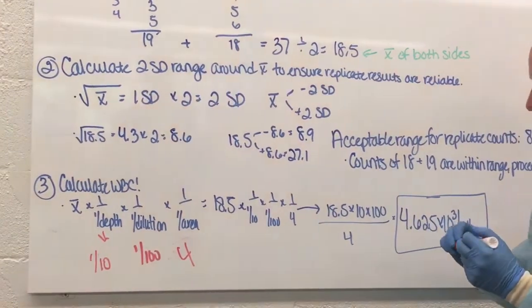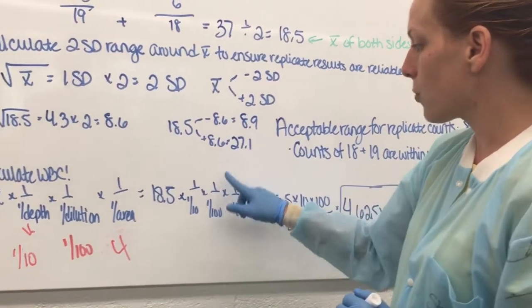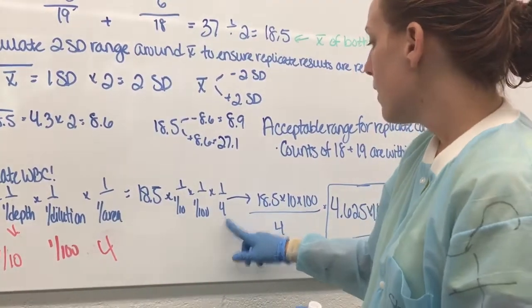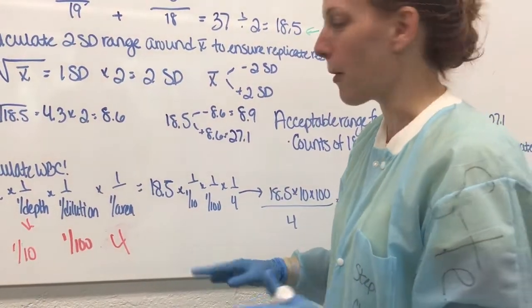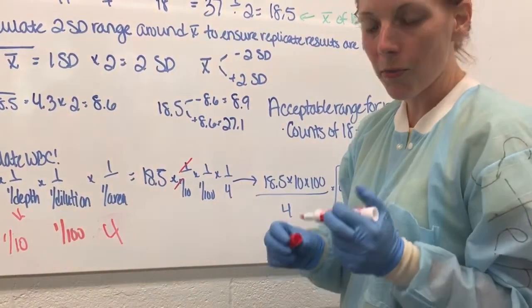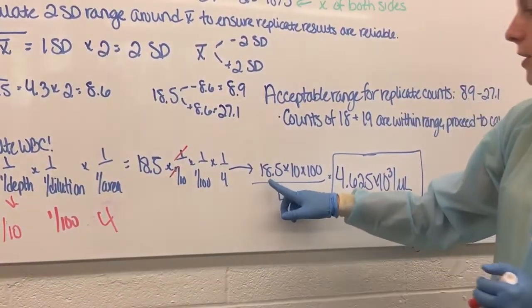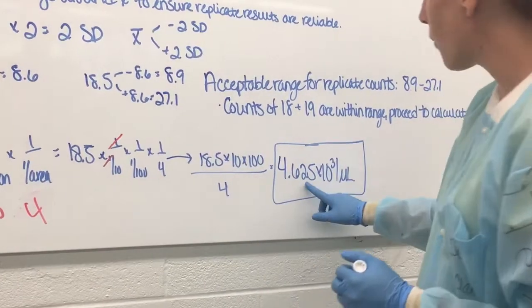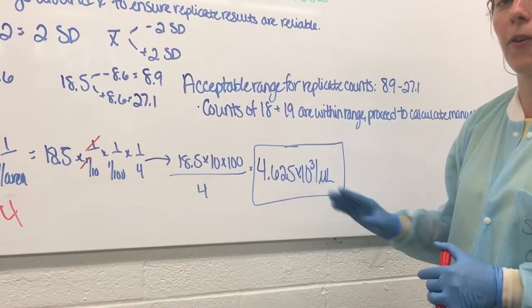So when we plug all of this stuff into our formula, we've got our mean times 1 over 1 over 10. 1 over 10 was the depth, times 1 over 100, which was the dilution, times 1 over 4, which was our area. Now, whenever you have fractions over fractions, there's more math than I really care to think about there. But all I really need to know is that whenever I have this, I get to cross out both of my numerators and my denominator just becomes a whole number. So when we fix up this equation, it turns into 18.5 times 10 times 100 over 4. When I do that math out, I get 4.625 times 10 to the third per microliter, which is a little bit on the low side for a white blood cell count.